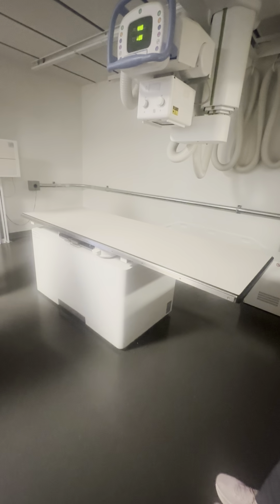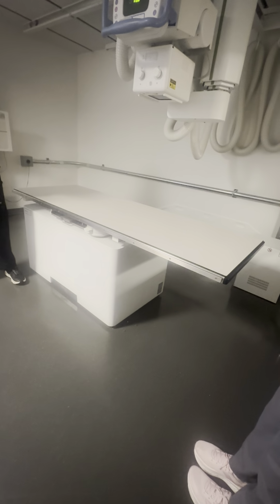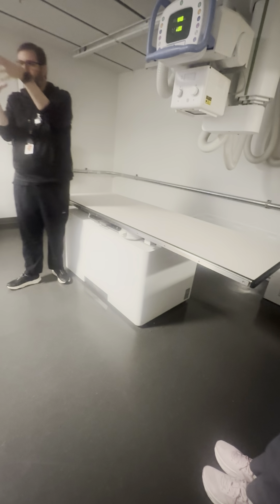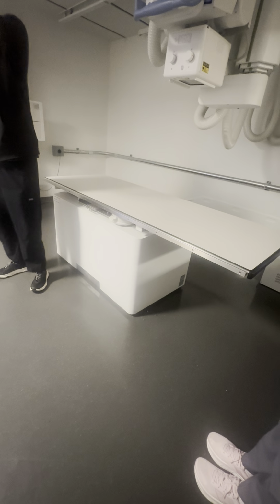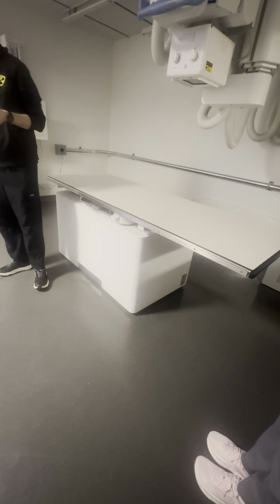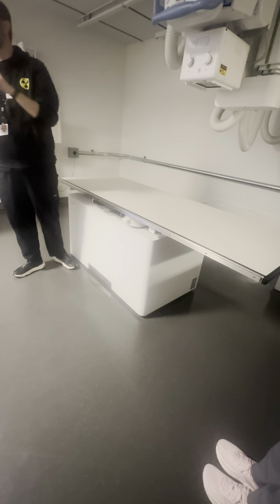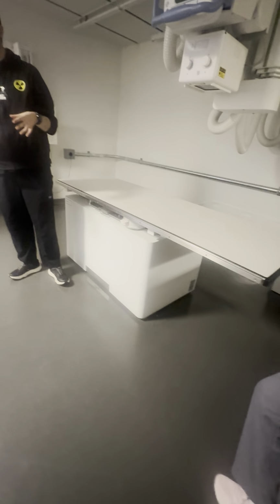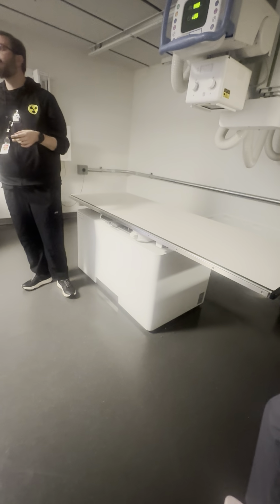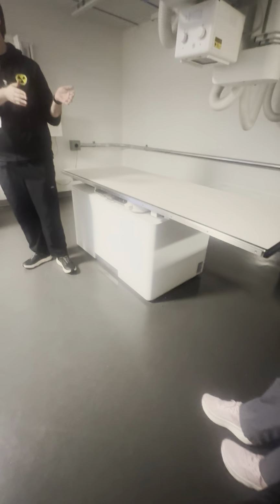So, you want to turn them onto their right side because your stomach empties to the right. Your stomach isn't this perfect globe. It actually goes posterior, superior, then there's a little hill in it, and it dumps down to the pyloric region and curves away to the right into the duodenum. So, by turning the patient slightly on their right, you do two things for yourself. One, you let gravity help pull the contrast down, so the exam goes quicker. Two, if they're going to reflux, the chances of them refluxing and aspirating are much lower when the patient's on the right side than the left.